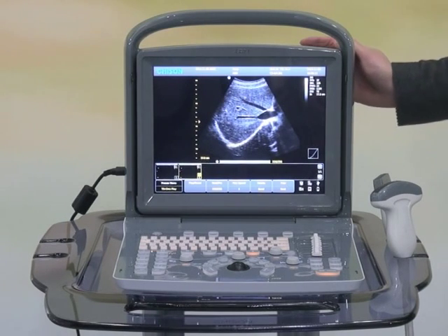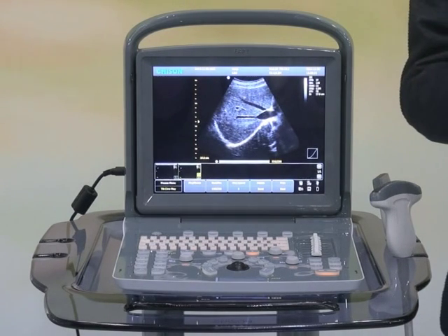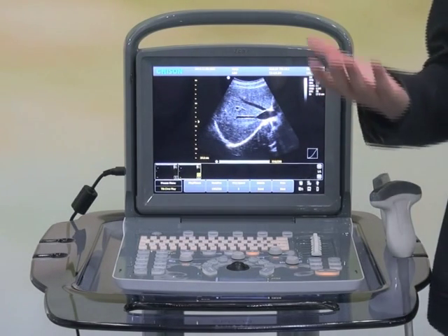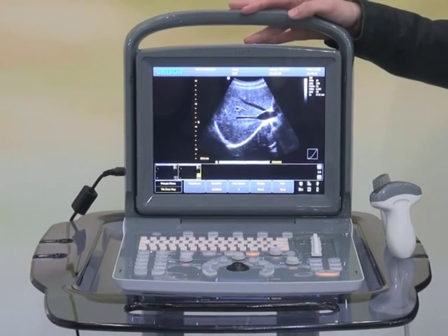By delivering these wonderful images, features, and advantages, AquaOne is not expensive at all. That is all about the presentation for AquaOne today. We wish you could join us to experience the magic of this little device.